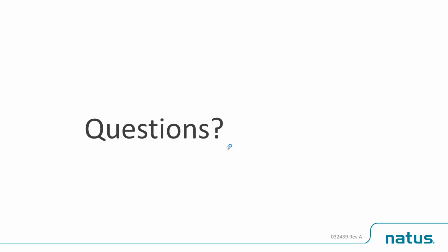So the thing on motor, and this is one of the reasons that we get good at our job, is because we want to do a supramaximal stimulation on motor nerve conductions, but we don't want to overstimulate either, because if we overstimulate, we'll get what I call stimulus jumping. So if we look at that nerve and we look at the nodes of Ranvier, that's kind of where the activation begins in the nerve. And if I stimulate too much, instead of activating the node right under the cathode, I'm maybe activating the one before it. Okay, so the stimulus spreads and activates the next node. Does that make sense? Again, if I could draw it, I could show that to you really easy.